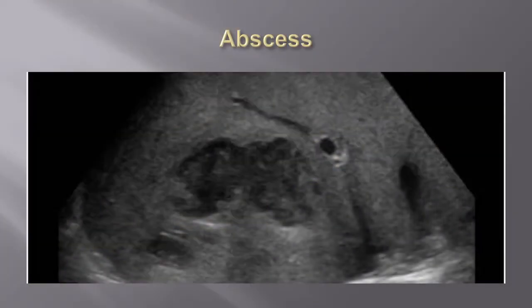There we go. There's a nice juicy abscess. So again, this is helpful. I got my transducer here. And look at that. You know you're going to get some good pus out of there. Now we can say from this that there's a lot of proteinaceous material in the abscess, because remember we said if it's just clear urine or cystic fluid, it's going to be nice and black.